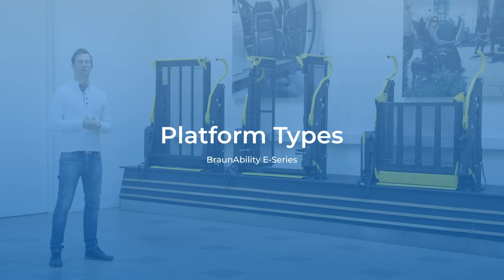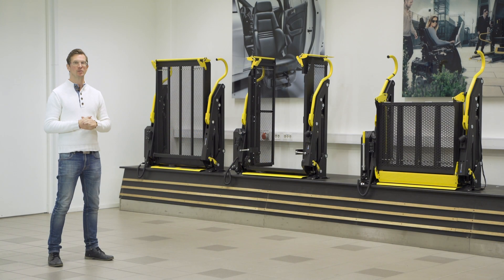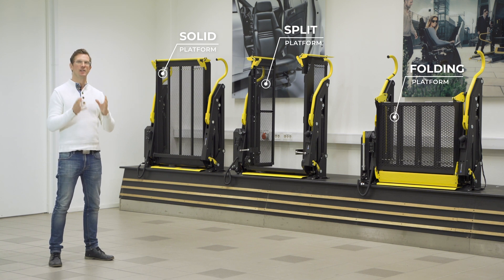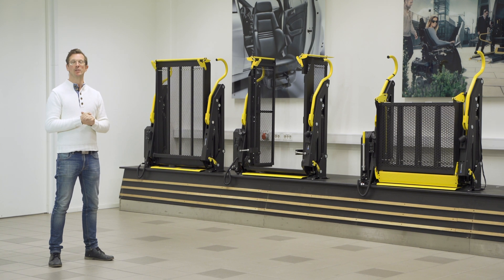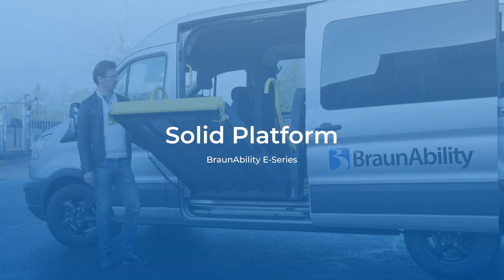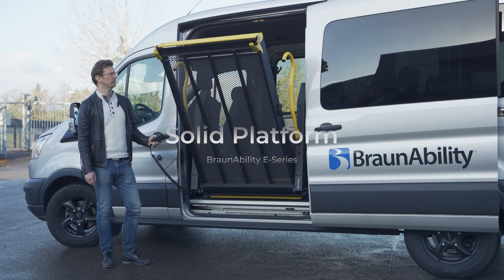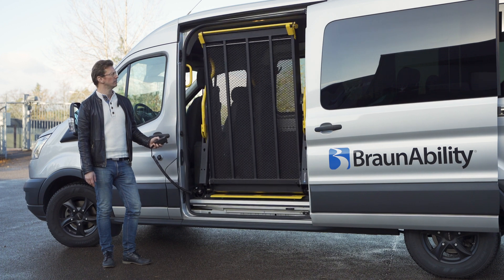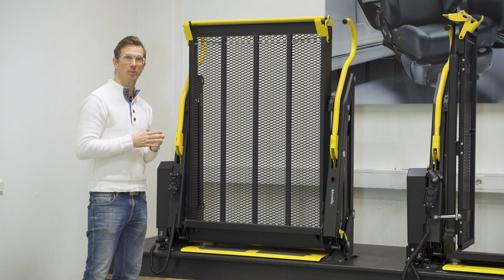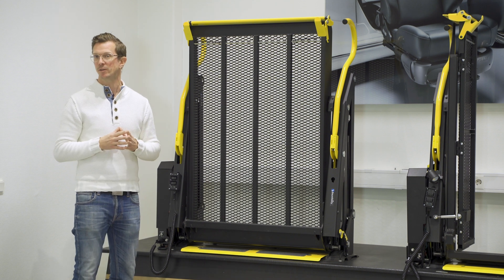The E-Series wheelchair lifts come in three different platform types: the solid, the split and the folding. Each of these have unique features and benefits, and all of them are installable in the rear or side doors of a vehicle. The solid platform is perhaps the most classic platform type of a wheelchair lift — it's a big rectangular shape with fewer moving parts than any of the other platform types, which means fewer adjustments during installation.